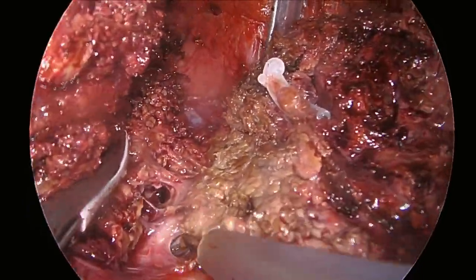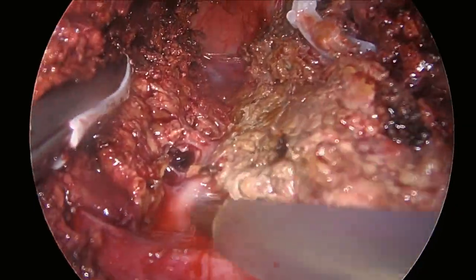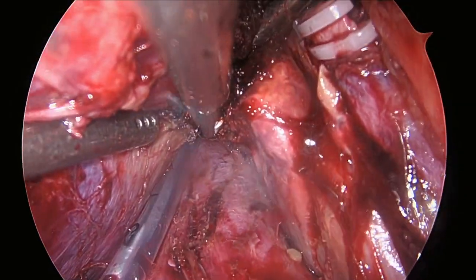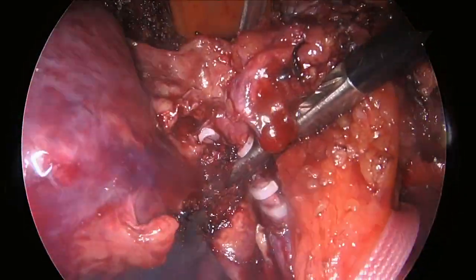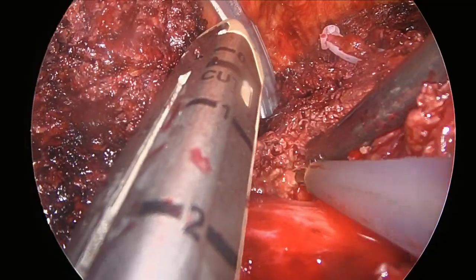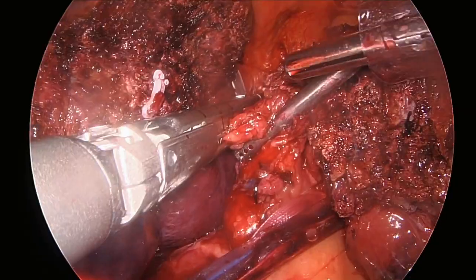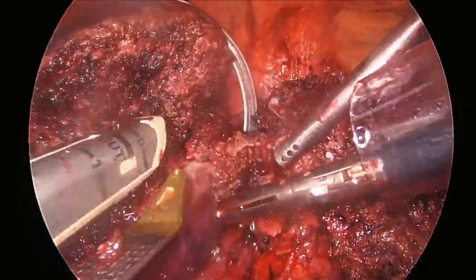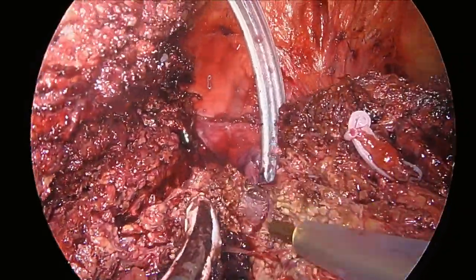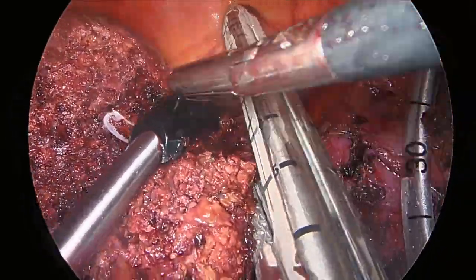There's little parenchyma remaining. Here we are identifying the cranial aspect of the hilar plate. The caudate process overlying the inferior vena cava is then divided so that we can get access to the hilar plate for division with an endo-GIA stapler. We aim the stapler towards the specimen side with an assistant providing counter tension on the future liver remnant to prevent any stricture on the left hepatic duct. Only a small amount of parenchyma and Glisson's capsule remains, and we now expose the right hepatic vein, which is then divided with an endo-GIA stapler.